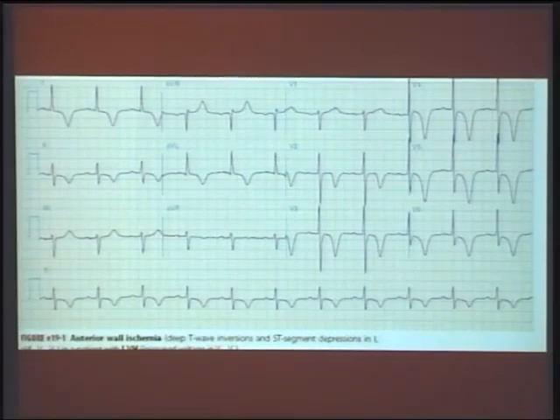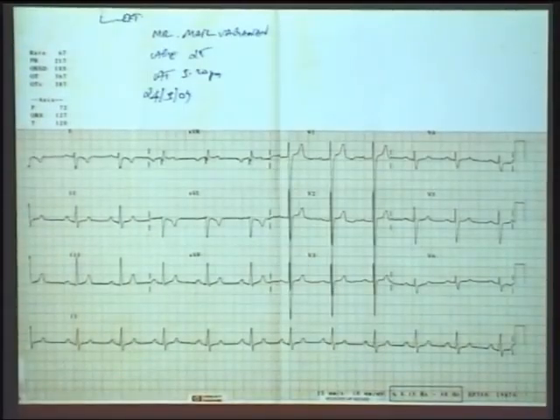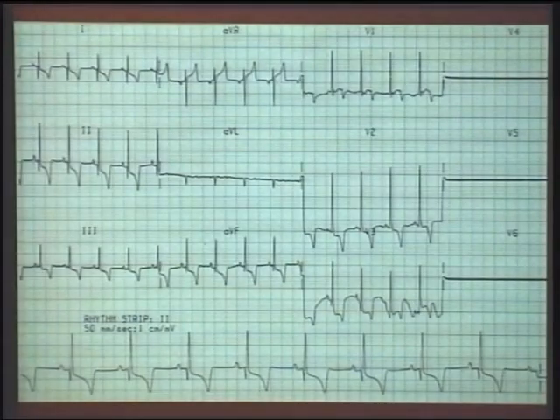Yes. L1. Horizontal heart, degrees, 0 degrees. Axis, normal. Lead 3, good. Within 1 second, you are now able to say, see the lead 3 is the tallest, isn't it? All the 3 leads. Lead 3 is the tallest. Axis, degree. Lead 3 again. Which lead to confirm here? AVL is negative. That means going away from your left side lead, coming towards your right side leads. So right axis.